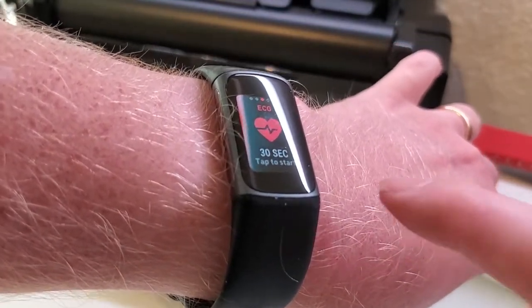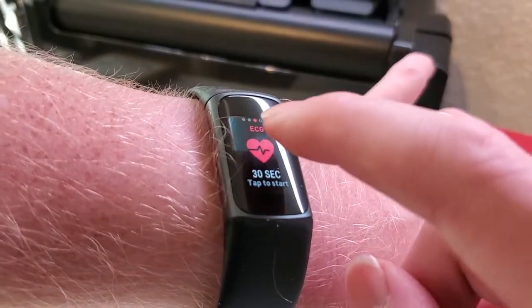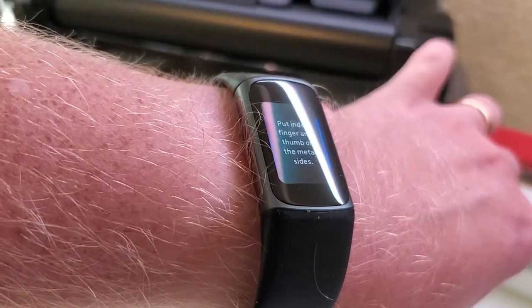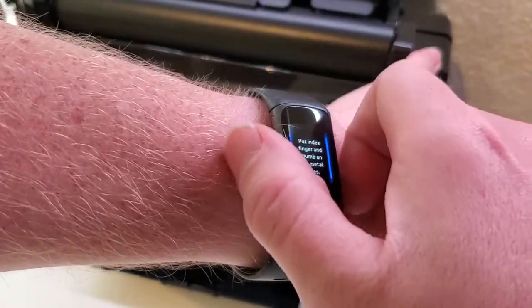It takes about 30 seconds. We're going to go to the ECG app here on the Fitbit Charge 5 — that's installed by default — and then we're going to tap to start our reading. It's going to say to put your finger and thumb on the side of the watch, hold them there for 30 seconds, and don't move and don't speak. So let's go ahead and do that.